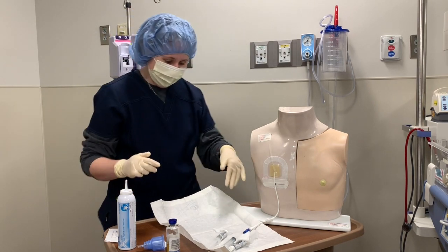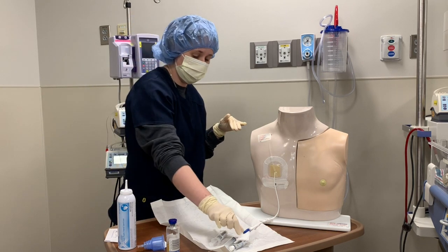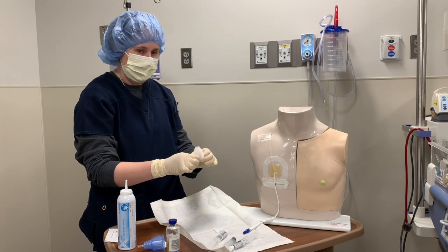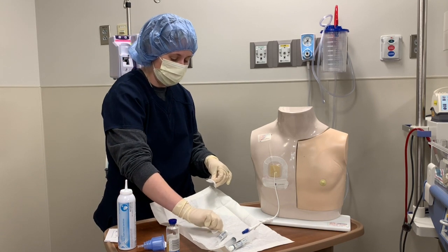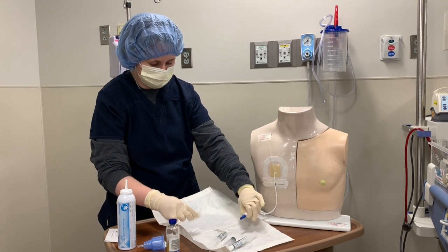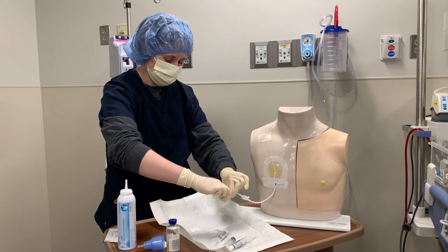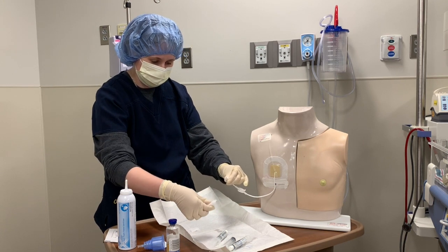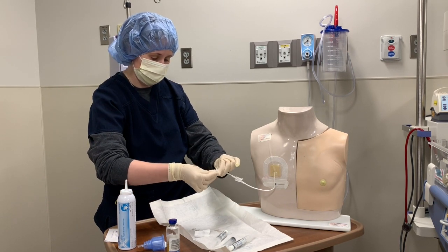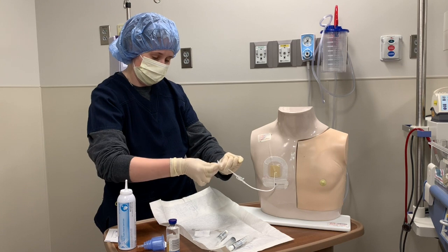If you haven't seen the newest version of the work instructions, you may be wondering why I needed 2x2 gauze. There are 2 pieces in a package — you take alcohol and one piece in one hand, and have the other piece in the other hand. You're going to unscrew the needless adapter here and let it drop so that you remain sterile without touching the dirty clave. Then take the alcohol and clean right here, and let the alcohol completely dry.